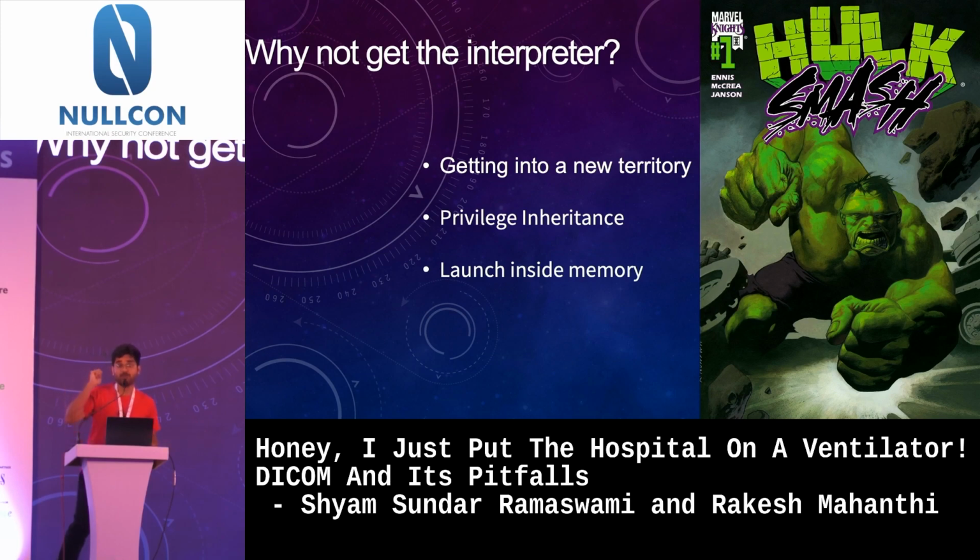Now there, I'm able to run a malicious process or a piece of code without even having the privilege to run it. Again, a classic example of process injection. The reason is the DICOM viewer runs in a privileged mode and you're inheriting the privilege of the DICOM viewer.